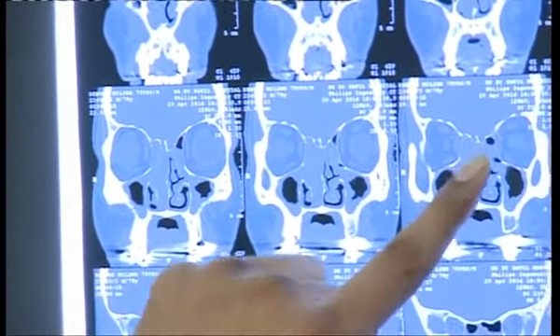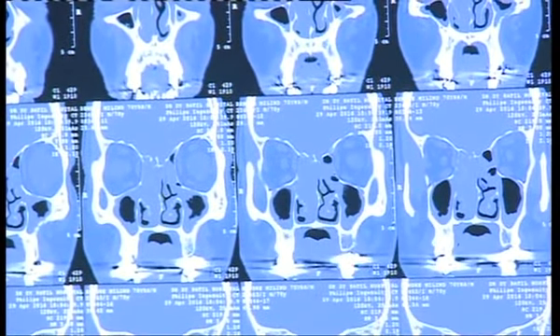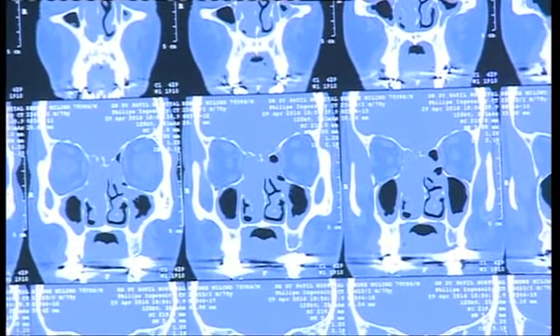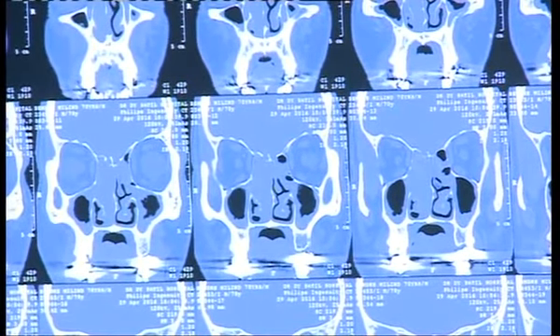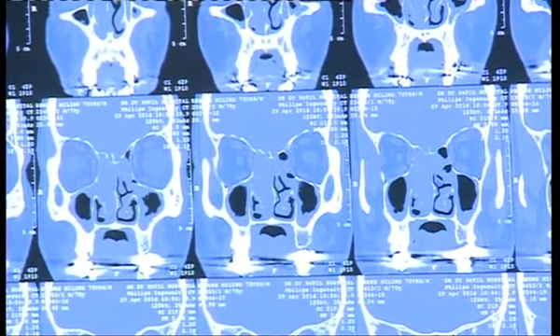And now you see exactly what is there. Can you see this coning of the medial wall? That beaking signifies the artery leaving the orbit. That's a very, very important point you can pick up on the CT scan. There are many ways to see. I will correlate the same in the surgery, how this artery can be correlated in difficult situations.